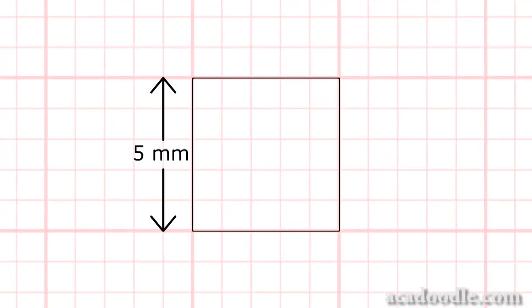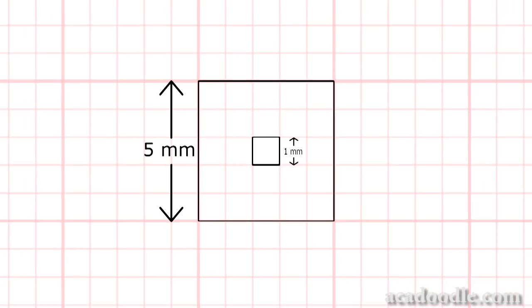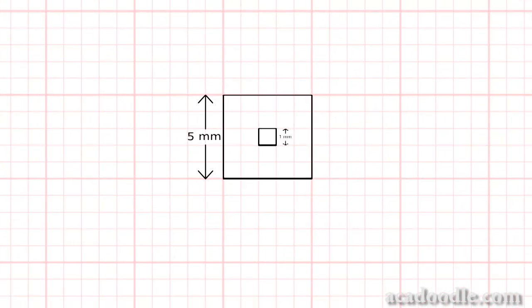ECG recording paper is divided into large squares 5 mm wide, and these large squares are in turn further subdivided into small squares, each of 1 mm in width. For our present purposes, we can consider that in all ECG machines, the recording needles run at a constant speed over the ECG paper of 25 millimeters per second. If you think about it, you will realize that this means that distance on the ECG paper equates to time.